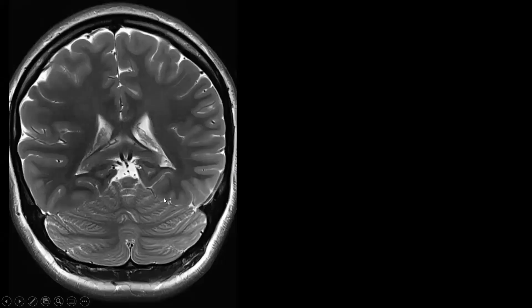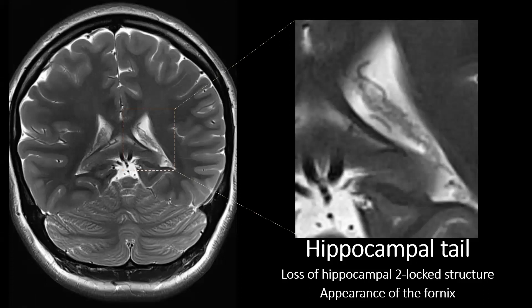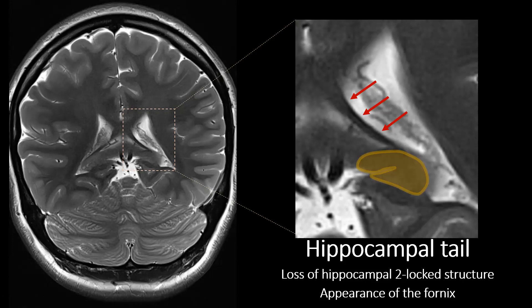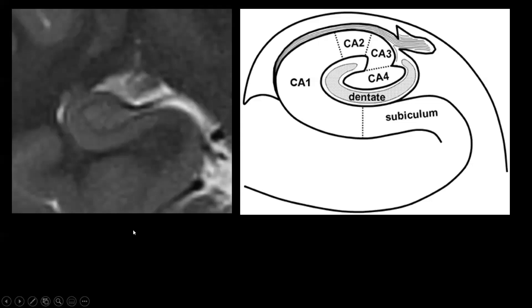Slicing a bit more posteriorly, we reach the level of the hippocampal tail. The hippocampal tail is a bit blurrier — we lose the normal anatomical distinction between the two cortical gray matter layers. At the hippocampal tail, we also see a white matter band appearing, which detaches from the hippocampal tail. This is the fornix — a white matter structure that connects the hippocampus with the mammillary bodies.